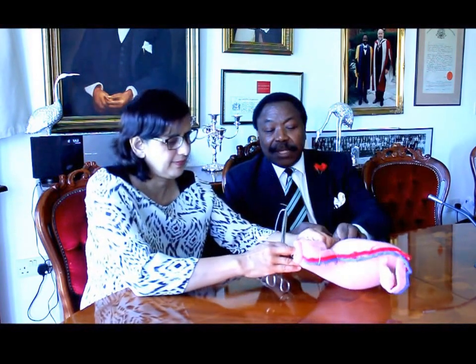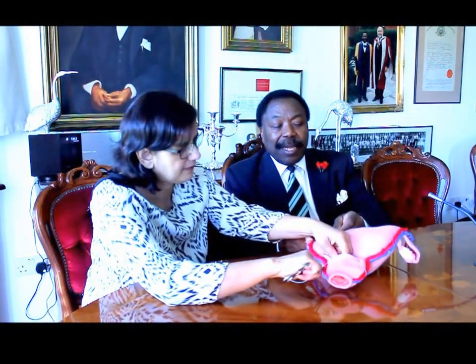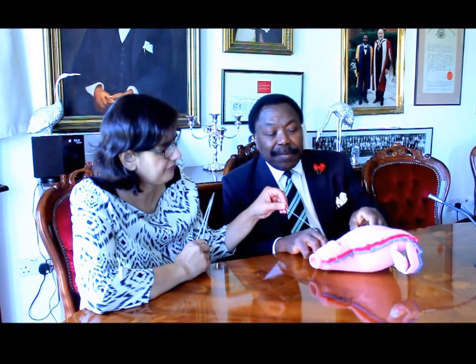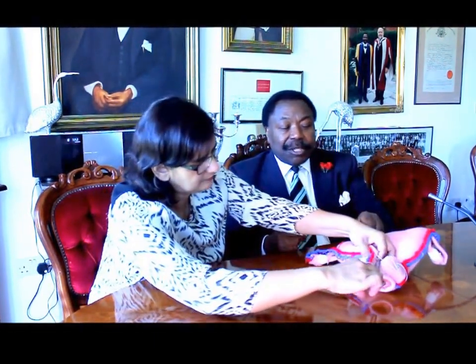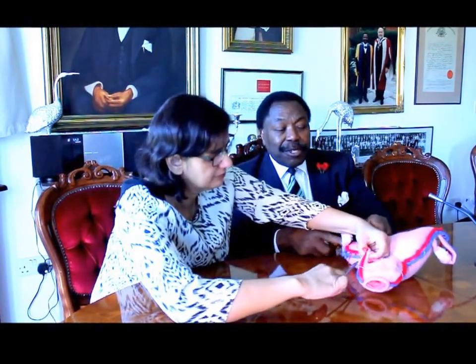From there, the assistant will go posterior to the vascular pedicle bundle layer to enter the uterine cavity. By doing so, an important demonstration is the occlusion of the upper part of the vascular system. The suture runs through and comes into the cavity of the uterus on the other side.